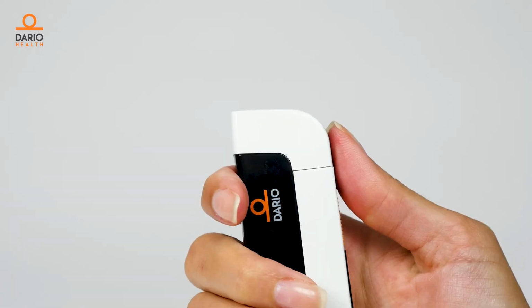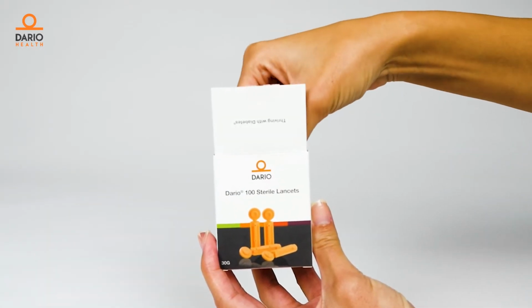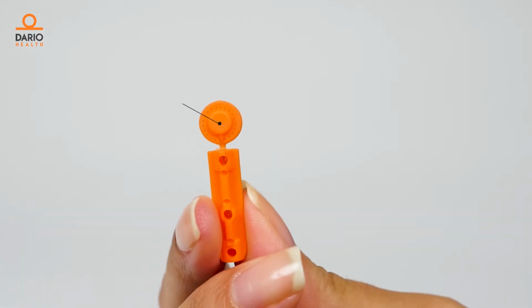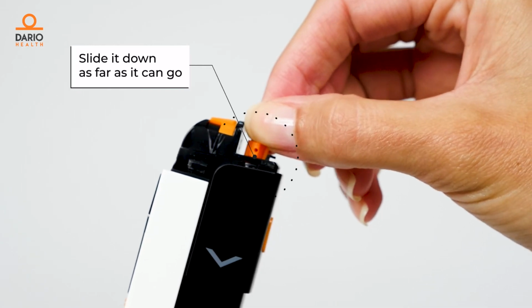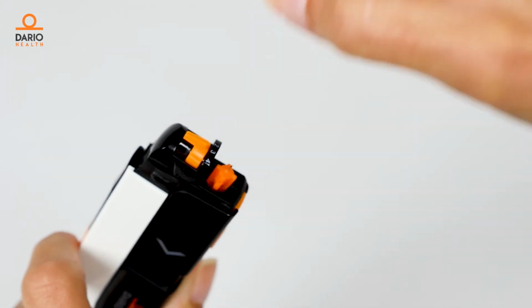Once off, take a new sterile lancet from the packaging. We recommend using 30-gauge Dario lancets. Keep the lancet cap on for safety. Now slide the lancet into the slot as far as it can go. Now you can safely twist off the lancet cap.